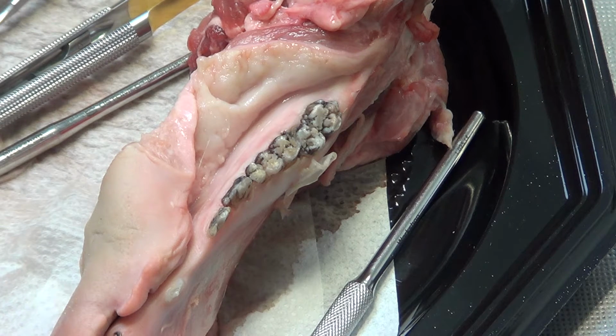Okay, now we have a vertical space in which we can put the free gingival graft. Otherwise, you don't obtain this space. Okay? Do you want to review it? Is it okay?